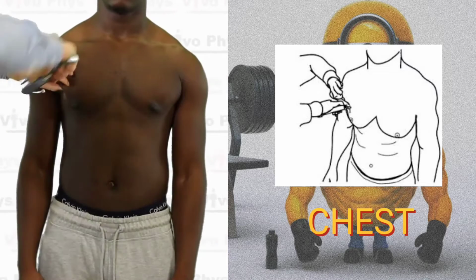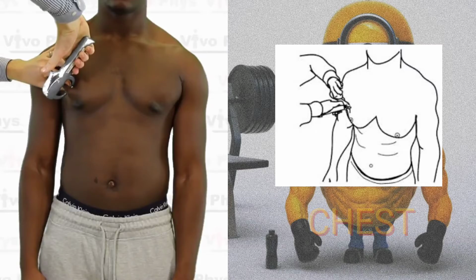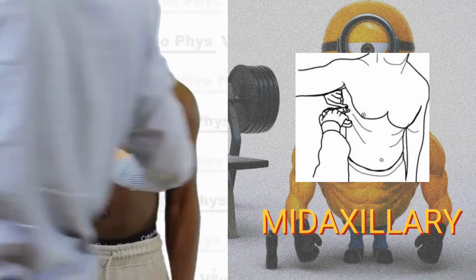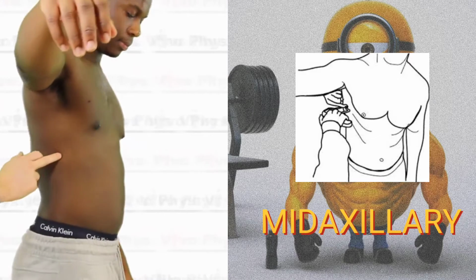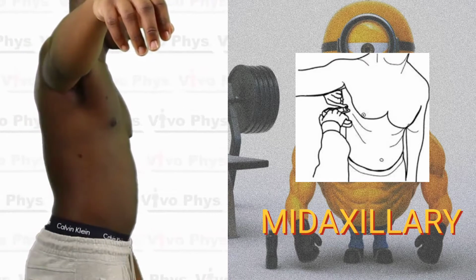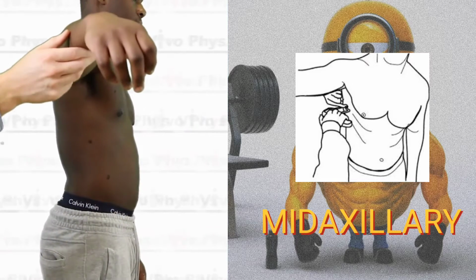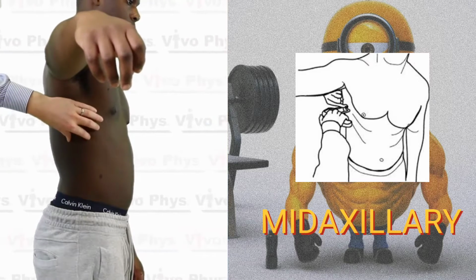For a male, you're going to go halfway between those two, and you're going to do a diagonal fold right there. The mid-axillary site is going to be at the level of the xiphoid process of the sternum, so the bottom of the breastbone. You find that and you go around to the right-hand side of the individual, and then you look for the center of the armpit and you go directly below that. Where the lines from the bottom of the breastbone and the center of the armpit intersect, that's where the skinfold site is going to be.